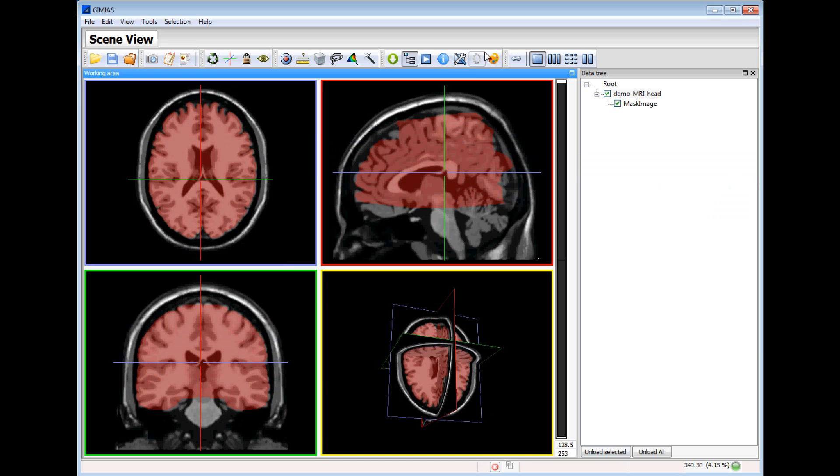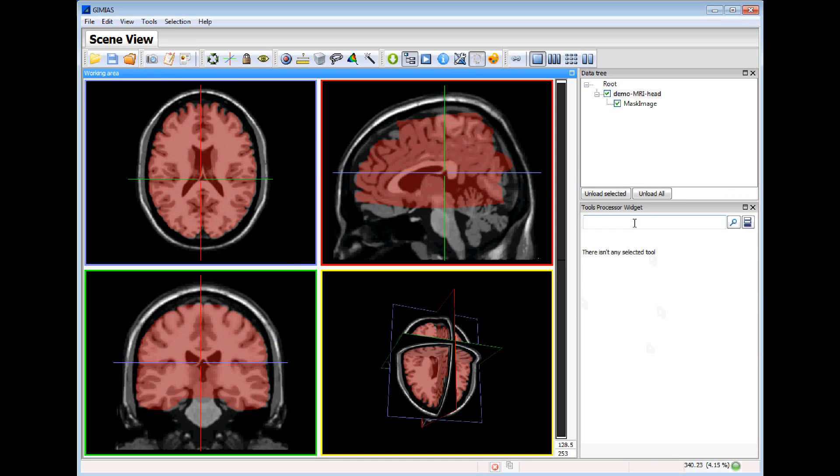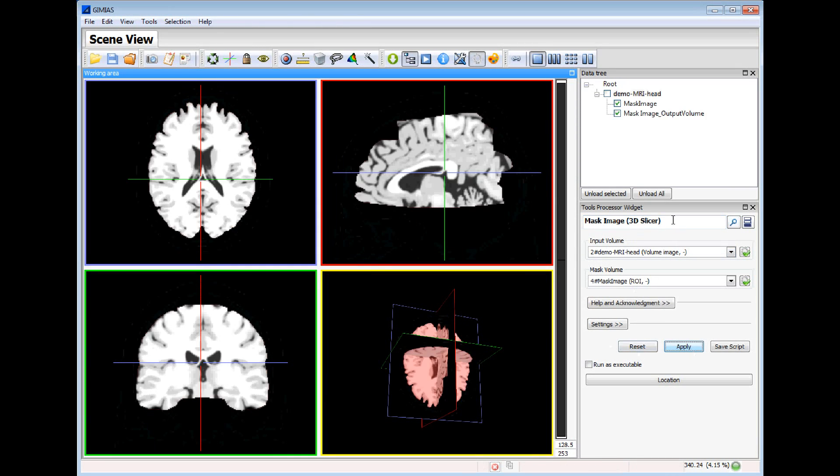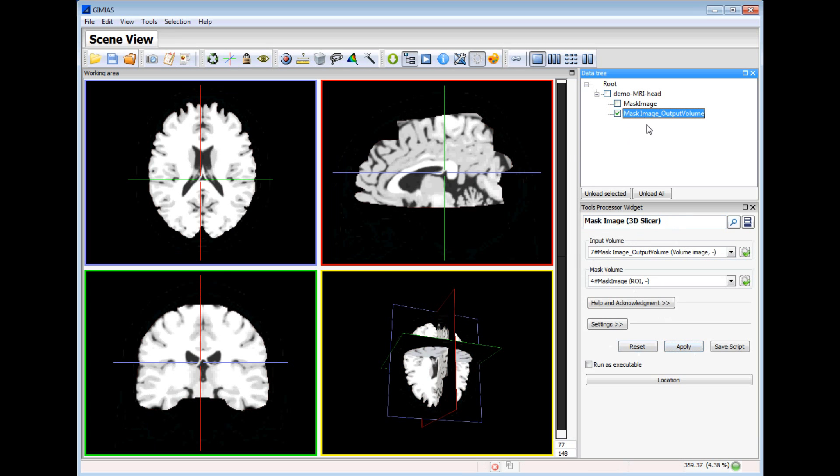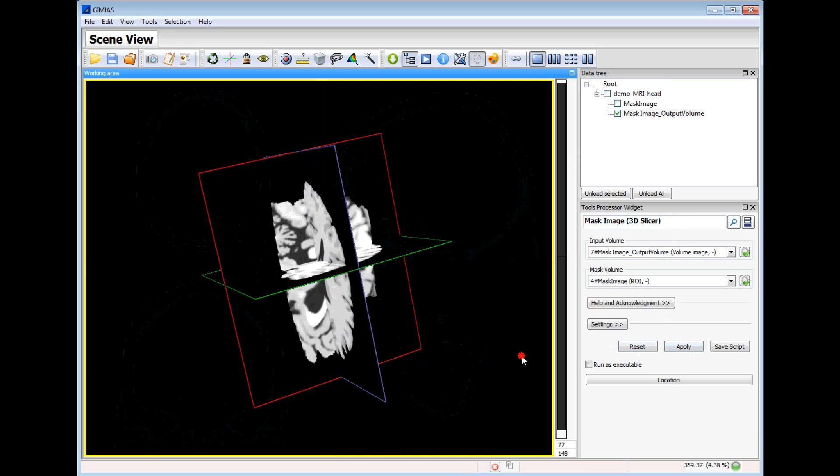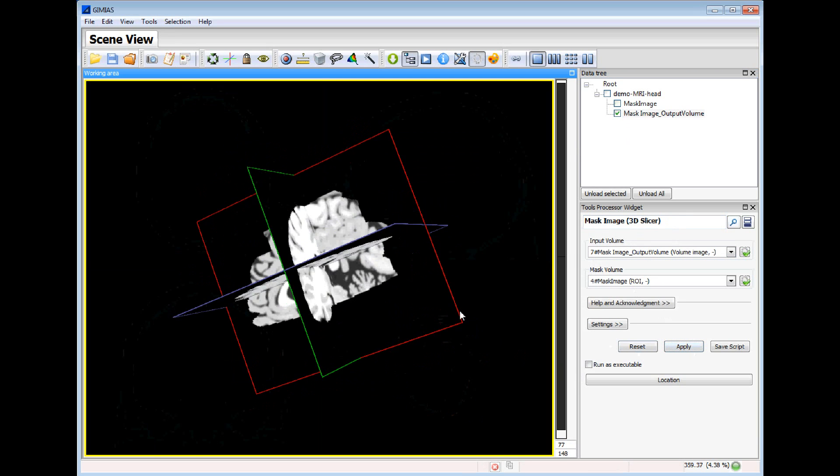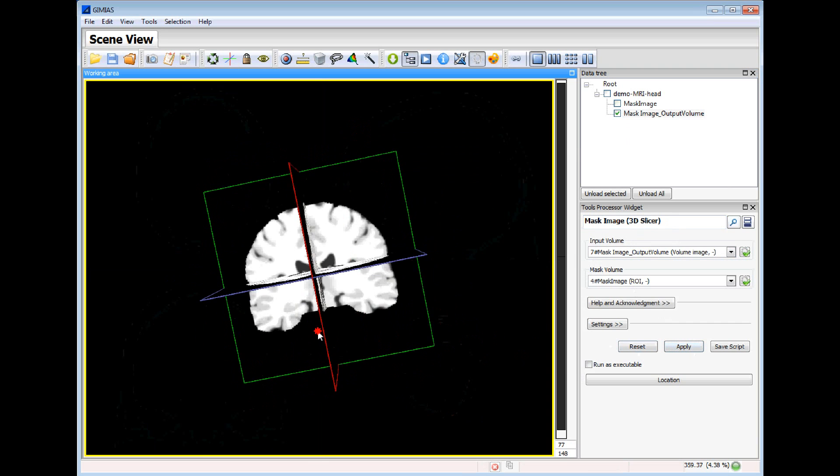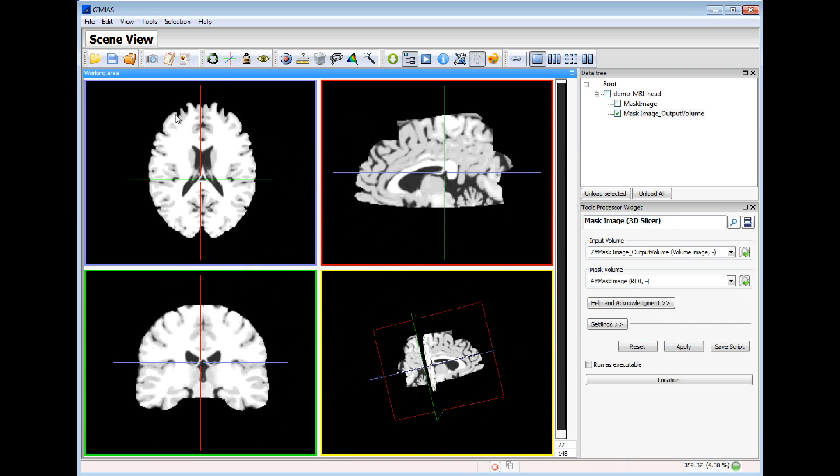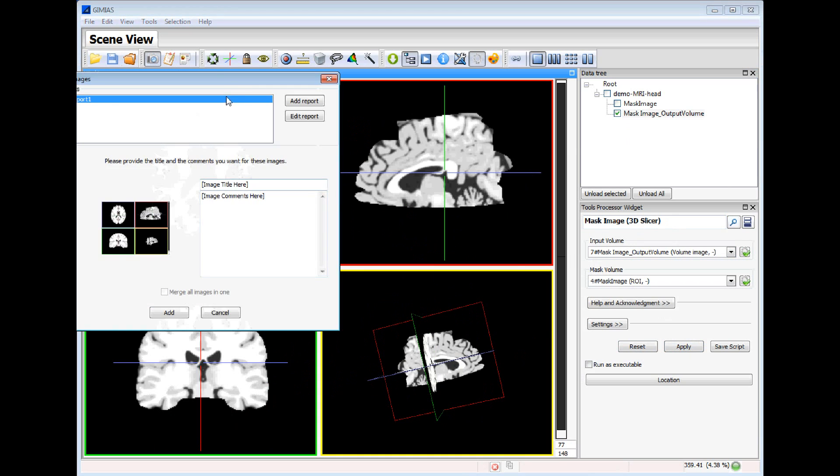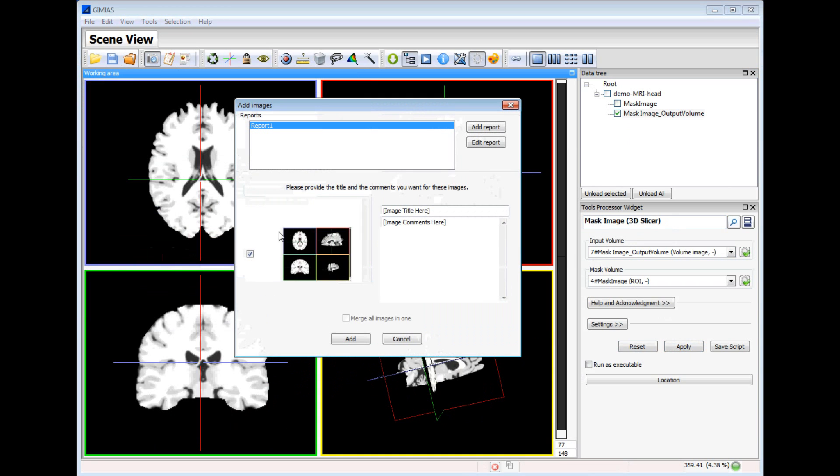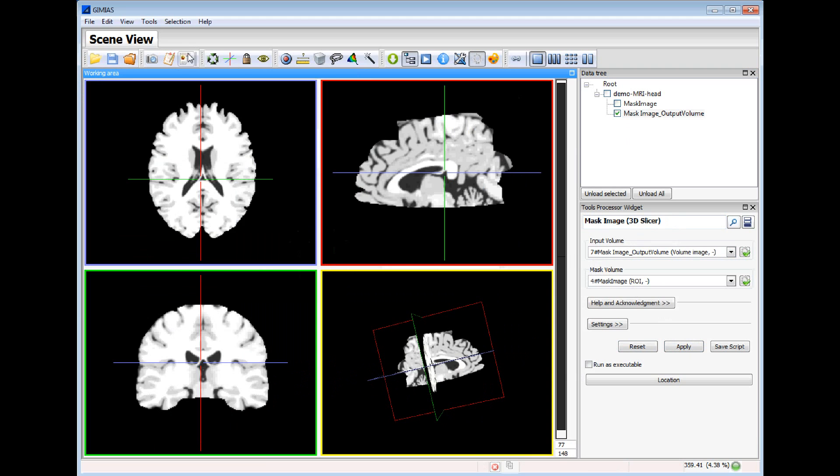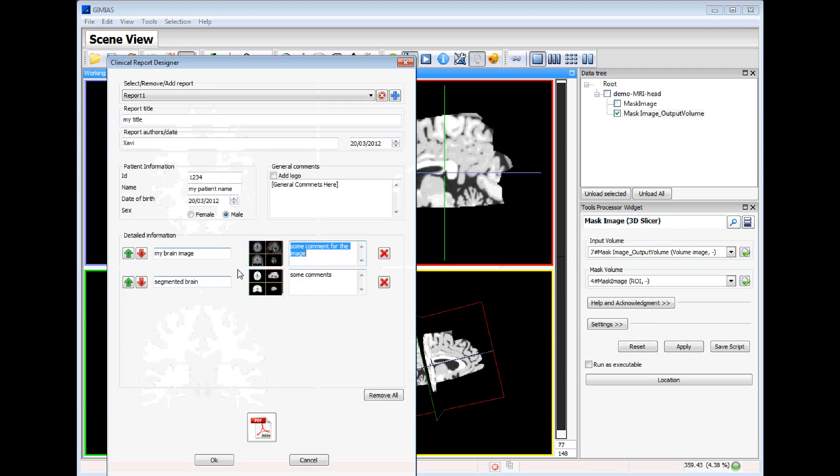Now what we will do is to use this mask image to extract this part from the input image. So this is the output volume of the segmented part of the brain. And we will capture this image. Segmented brain will be the title and some comments. And we can see that this is a second snapshot.